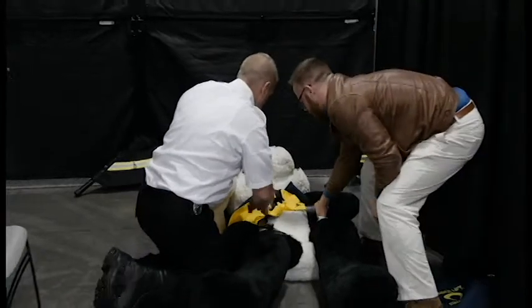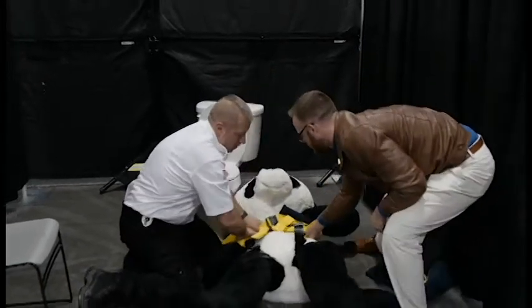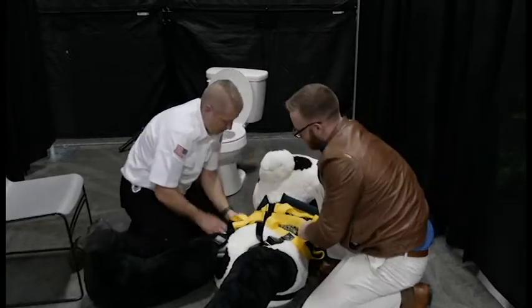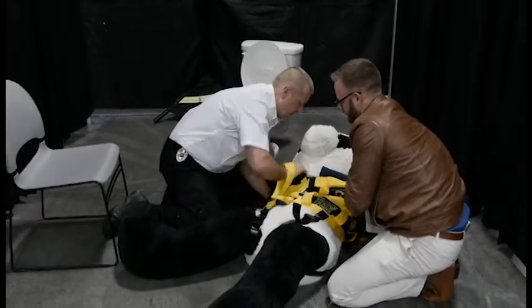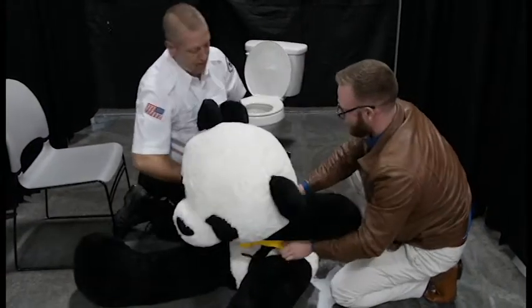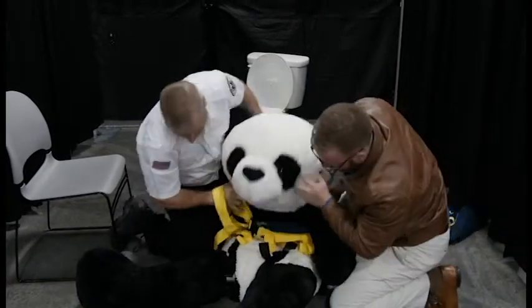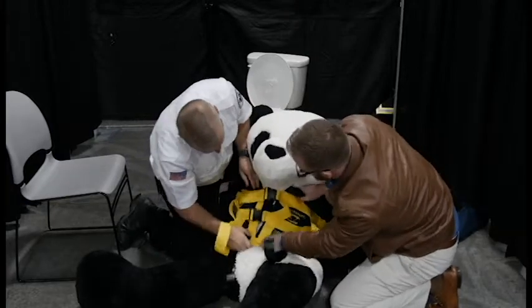Now you're going to grab the handles here and pull the patient out into a more open area. You're going to sit the patient up. Once the patient's sitting up, you can pull the Bender lift down into place and go through and tighten up the torso straps.